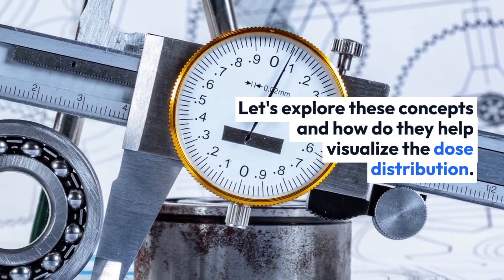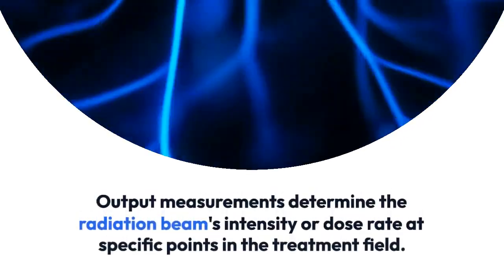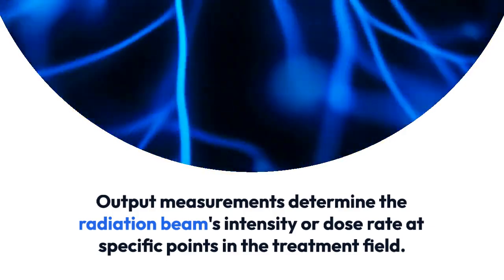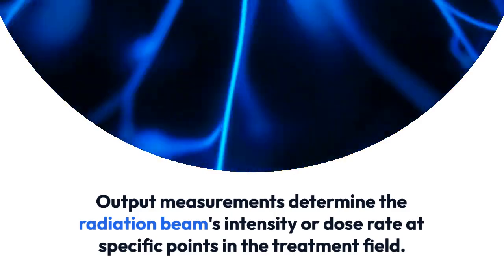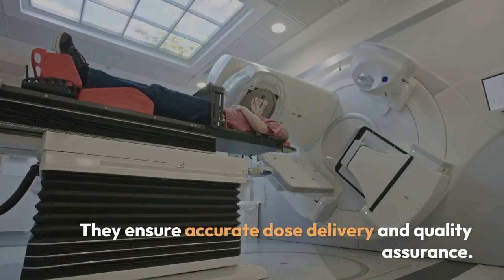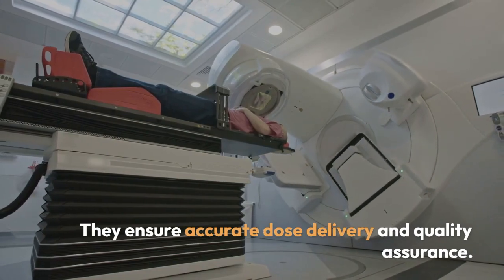And how do they help visualize the dose distribution? Output measurements determine the radiation beam's intensity or dose rate at specific points in the treatment field. They ensure accurate dose delivery and quality assurance.